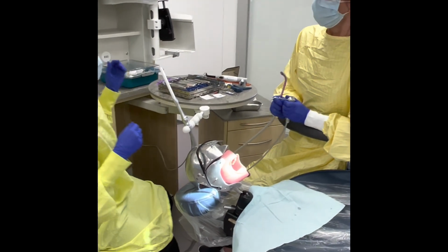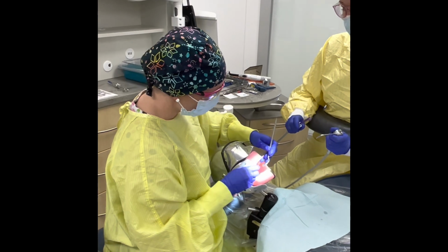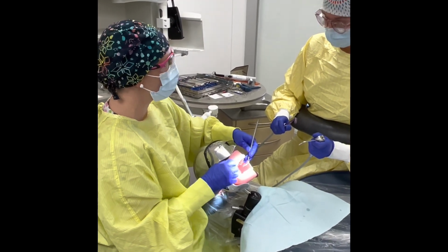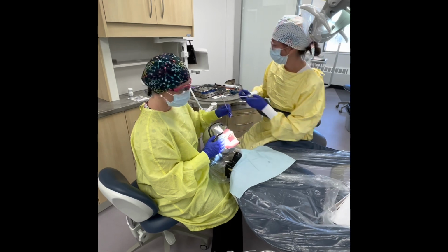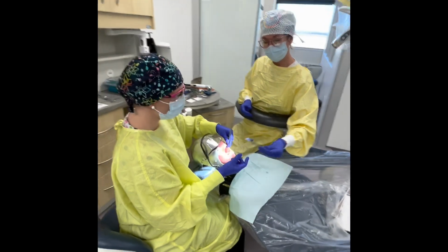Okay, perfect, Stacy. So that looks great. I'm going to take a look here. Now what we're going to do is adjust or check the bite, okay? So we'll start with the posterior tooth. Okay, I'm just going to dry that. So Stacy's using her air water syringe. You could use gauze, but you have the air water in your hand anyway, so you're going to use that.